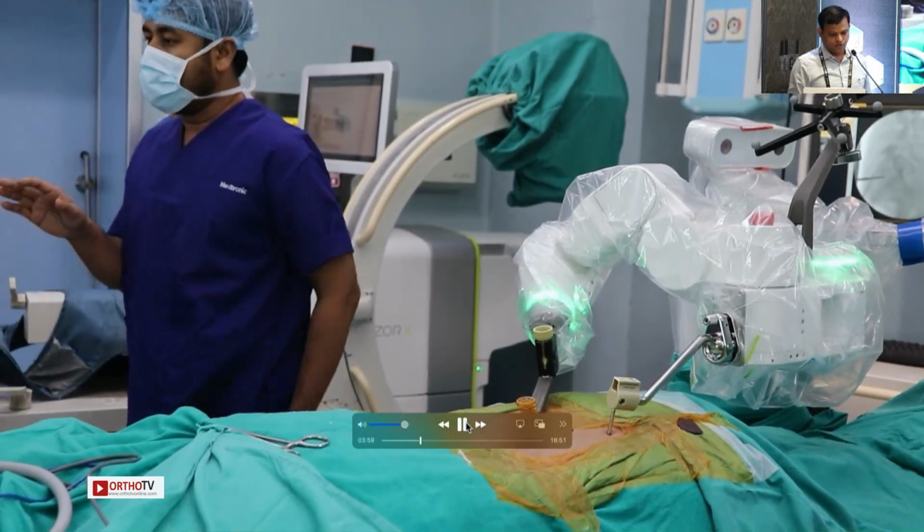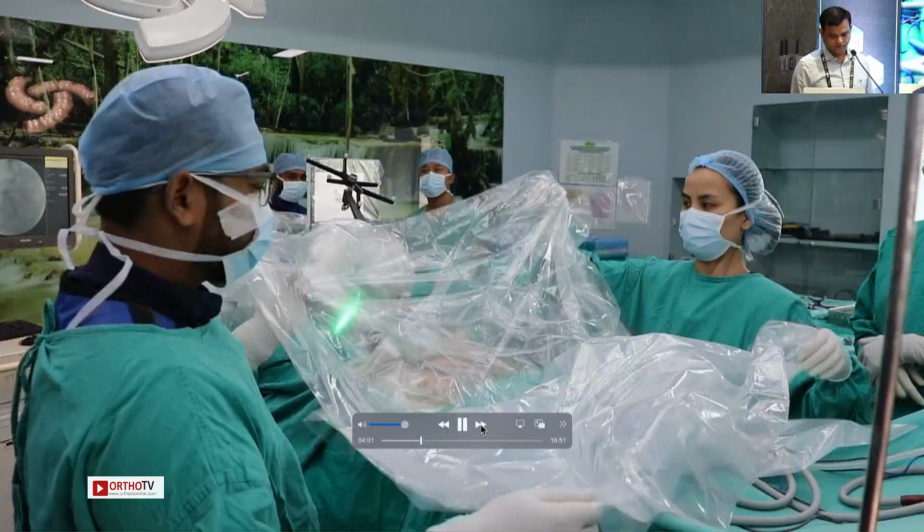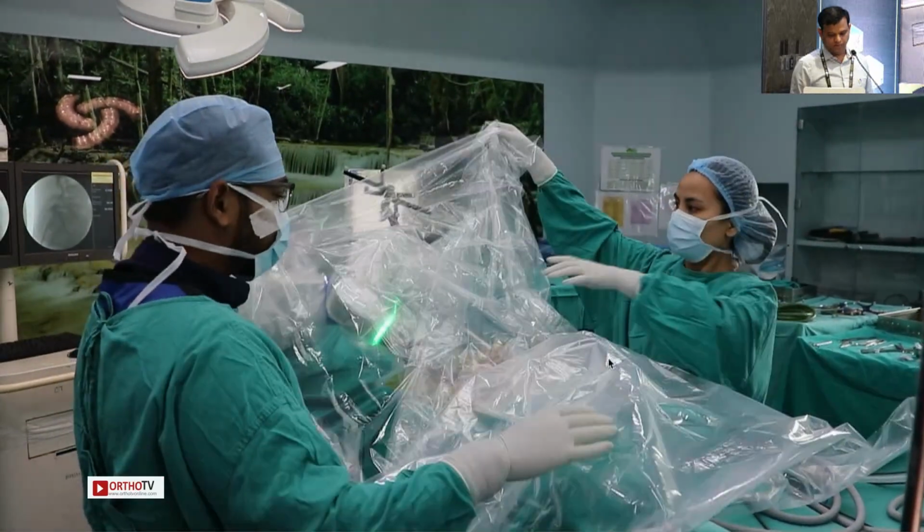Okay, so now we bring in the O-arm. So you drape.